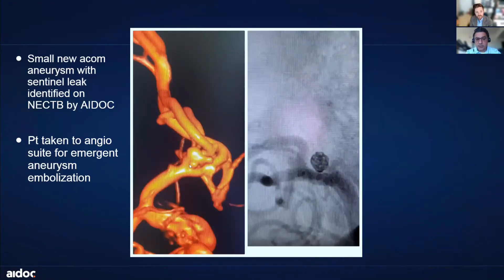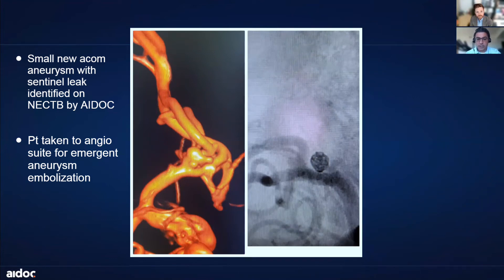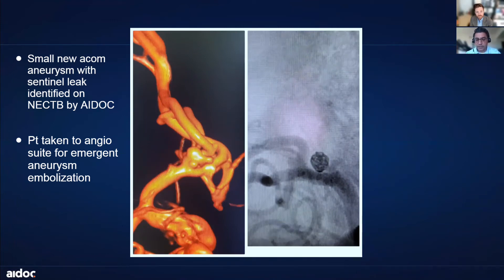Here is the three-dimensional imaging of the angiogram that shows a multilobulated, irregular aneurysm that, if it had gone undetected, more than likely would have re-ruptured within the next two weeks and could have been catastrophic for this patient at worst. At the very least, it would have caused a prolonged hospital stay with inpatient rehab. Rather, we were able to go in and embolize it endovascularly, and the patient stayed in the ICU for 12 days and then went home after that.